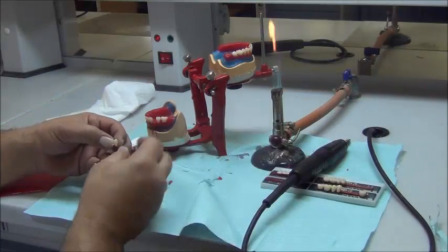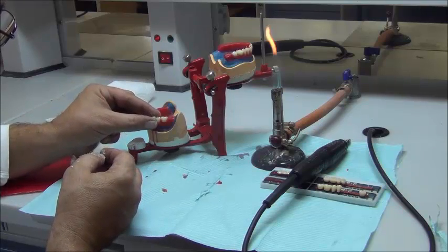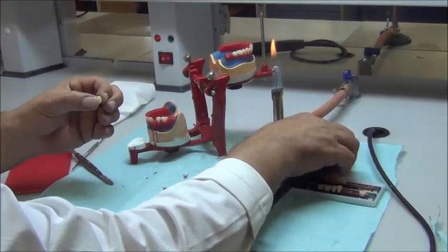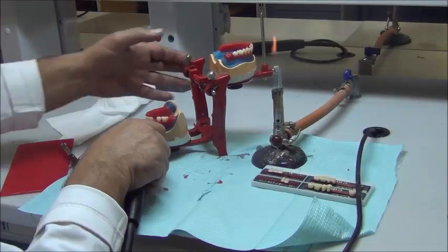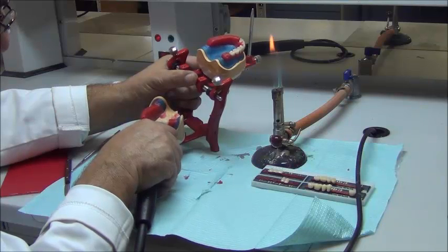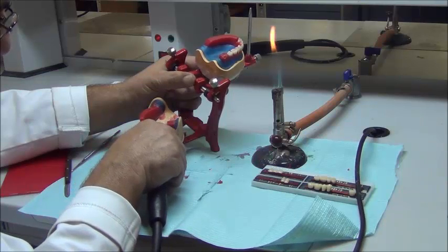If I find that the occlusal table will be ruined and the tooth becomes abnormal in shape, we can also remove from tooth number 5 as well. So now we could also remove from tooth number 5 mesially, and this will also give us extra space.